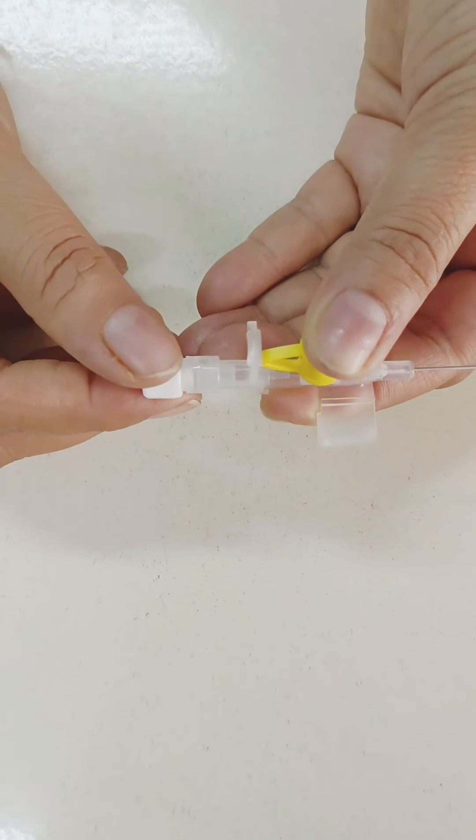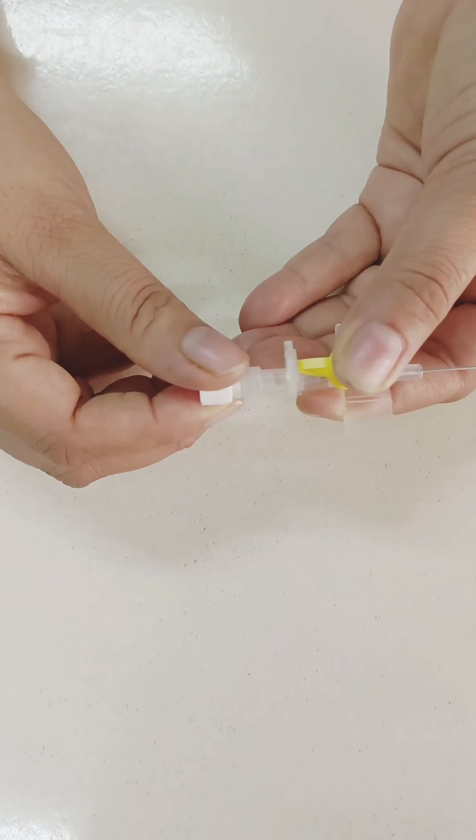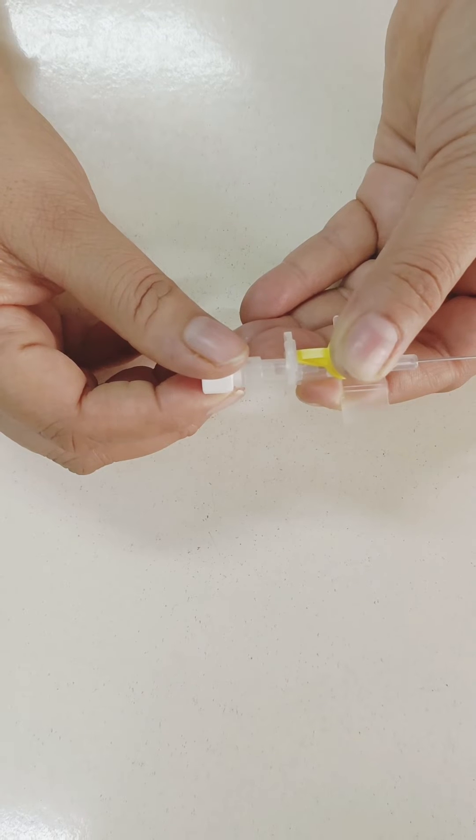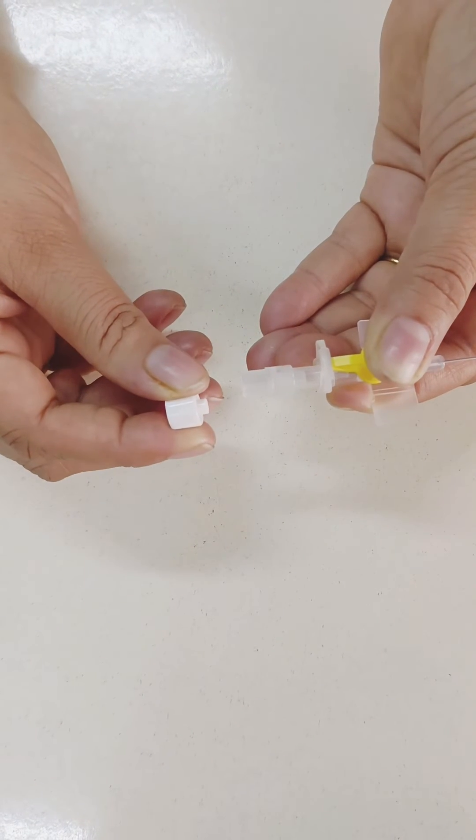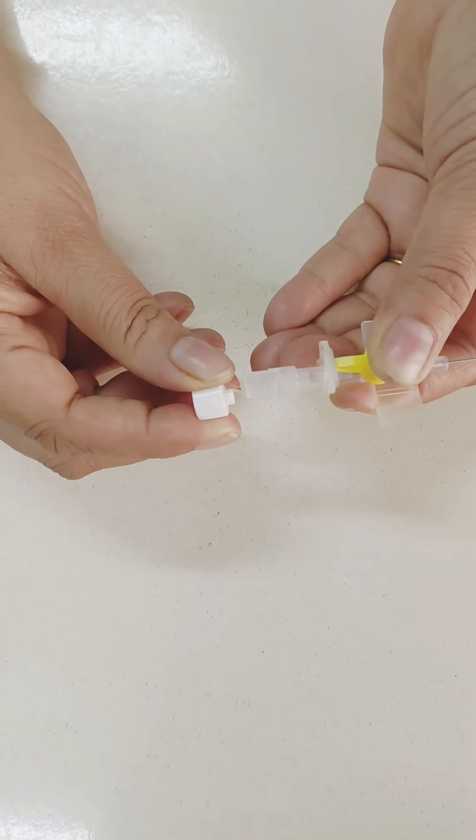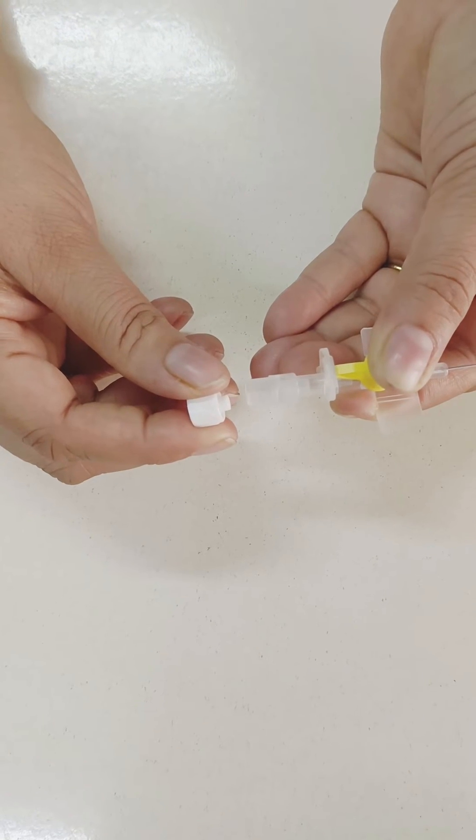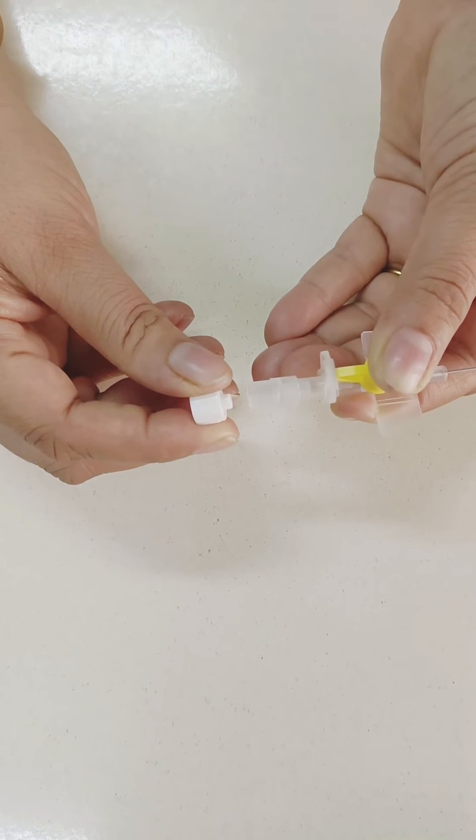This is lure lock plug. After proper insertion and fixation of intracath, this lure lock plug is removed to give IV injection or IV infusion.